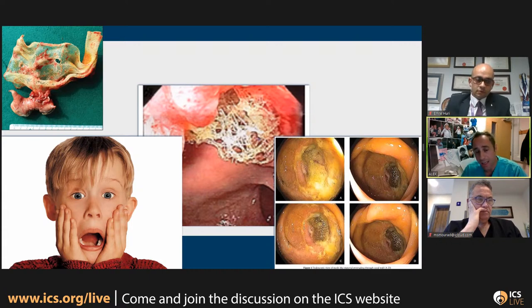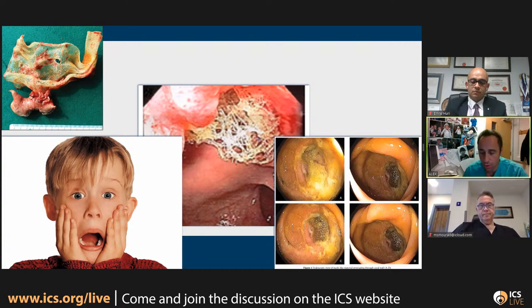So I started thinking, well, if I have to suspend the uterus to the sacral promontory using a mesh, do I really need to do all the dissection of the peritoneum of the pouch of Douglas? Do I really need to bury that mesh? Probably I don't need to bury the mesh, but my main worry was the reported complications, such as erosion or extrusion of the mesh into the surrounding organs.